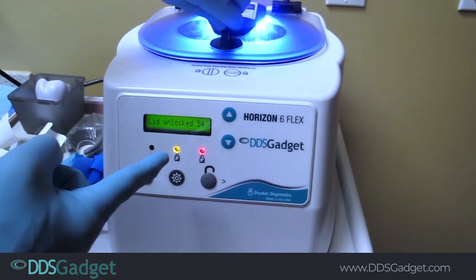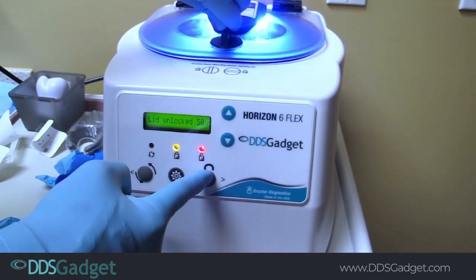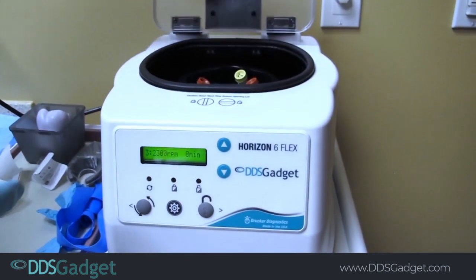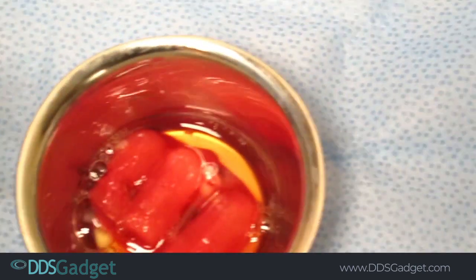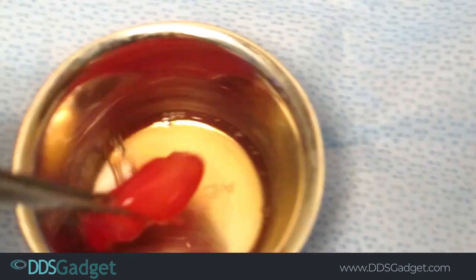It just beeped and it told us it's ready. It's going to stay unlocked for 50 seconds and then lock — just push the unlock button and take it out. We're going to rotate and take out the tubes.